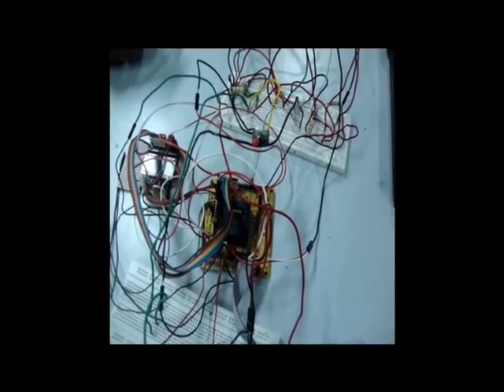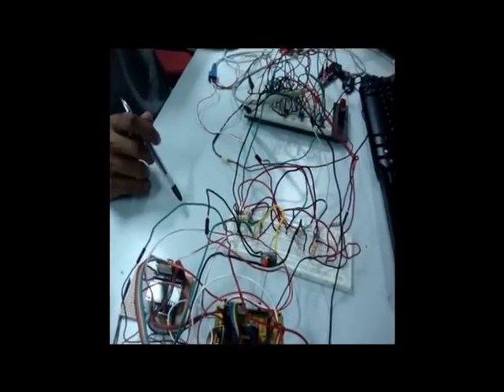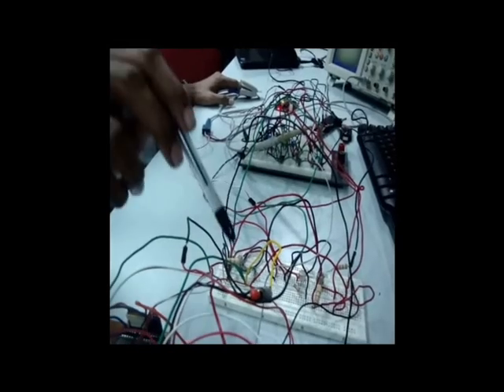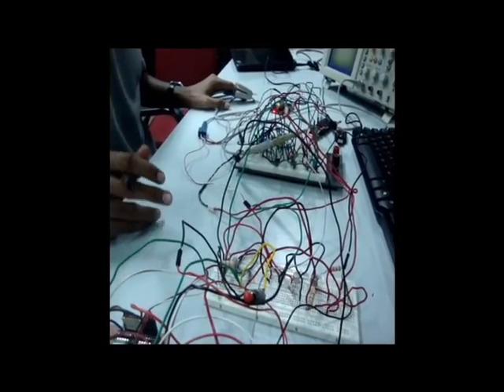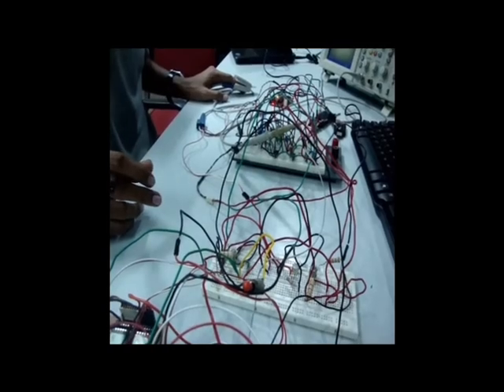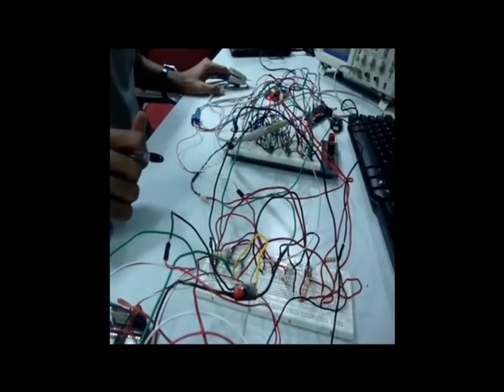Now we shall be showing you the demonstration. Our device operates in two modes, the heartbeat mode and the SpO2 mode. We have kept this switch for the user to switch between the two modes, depending on whether he wants to see his heartbeat or oxygen saturation. First we shall be operating our device in the heartbeat mode.